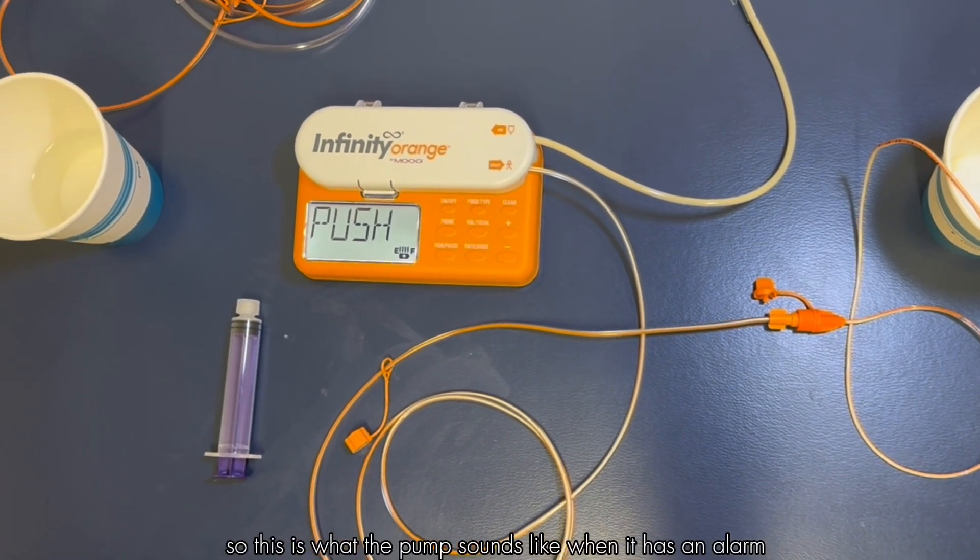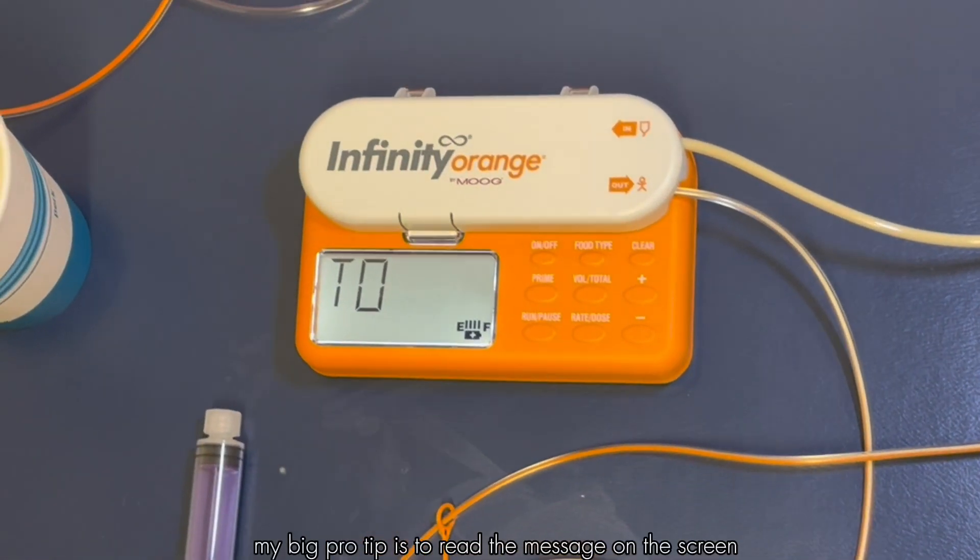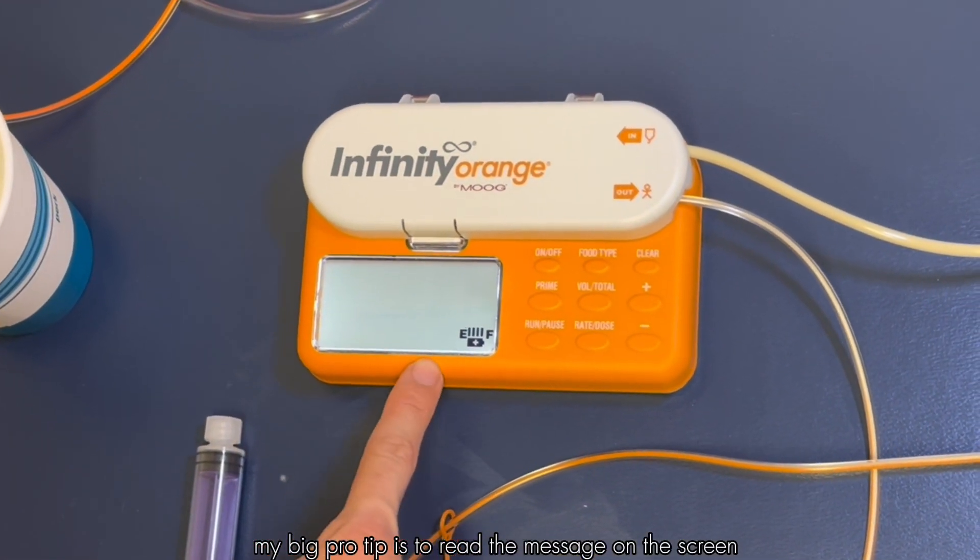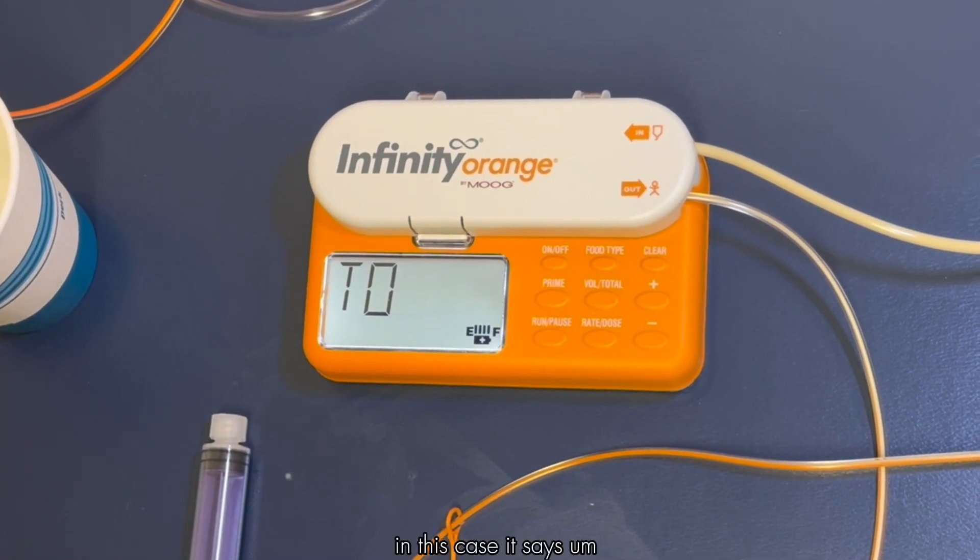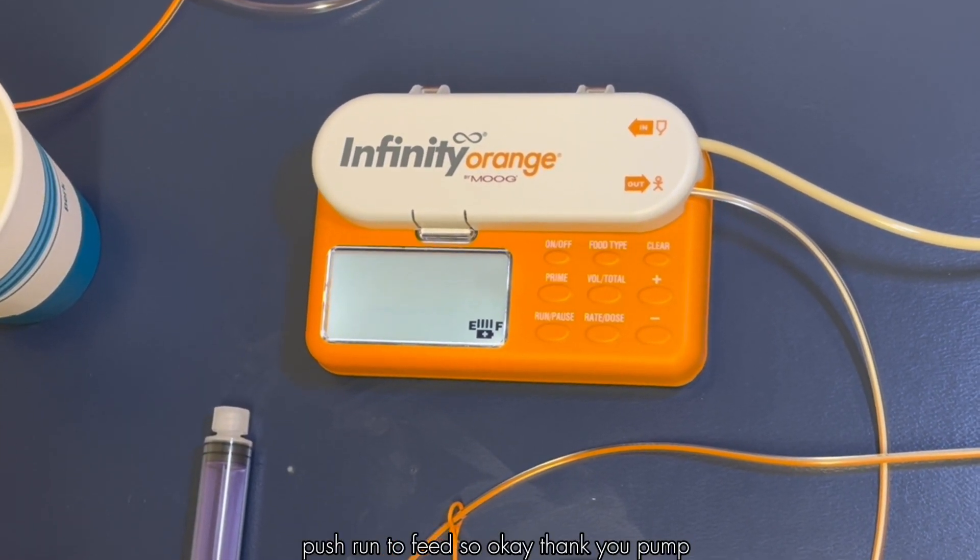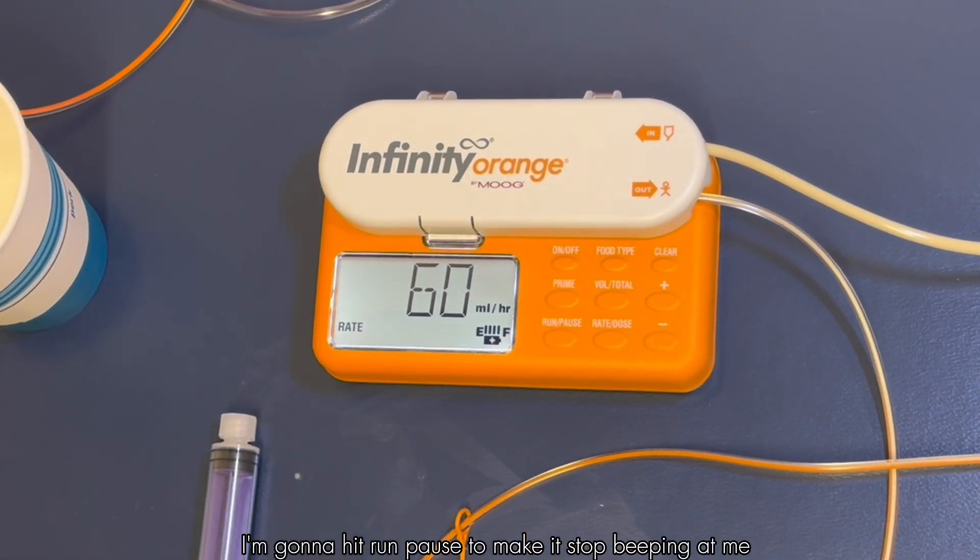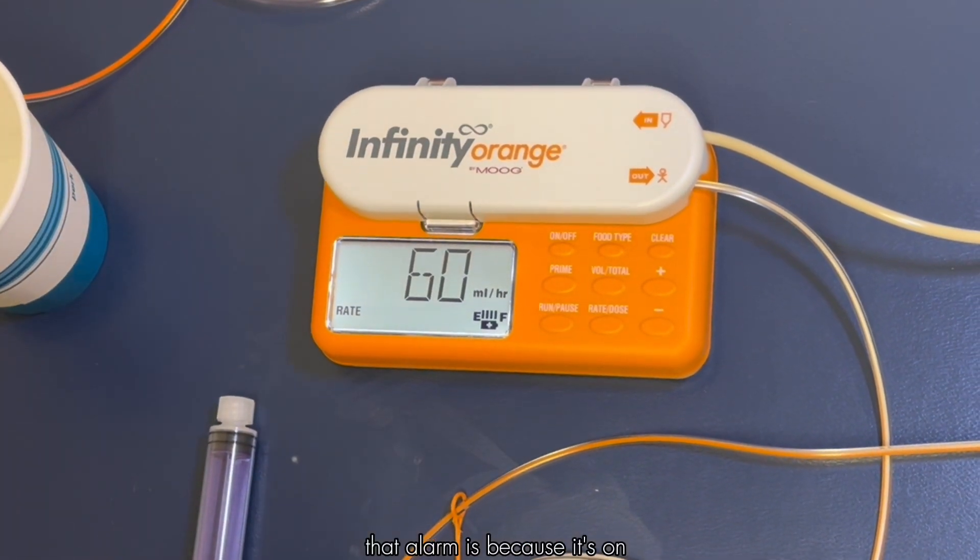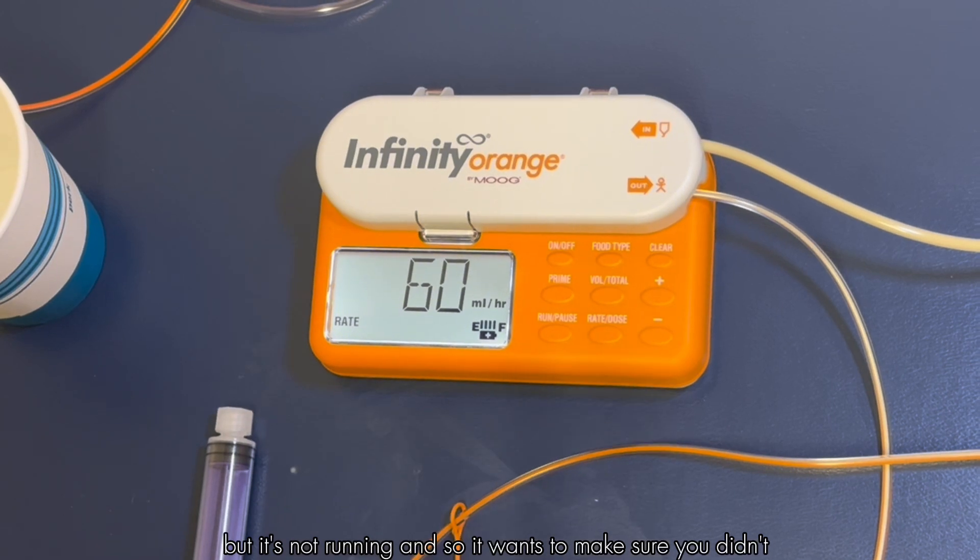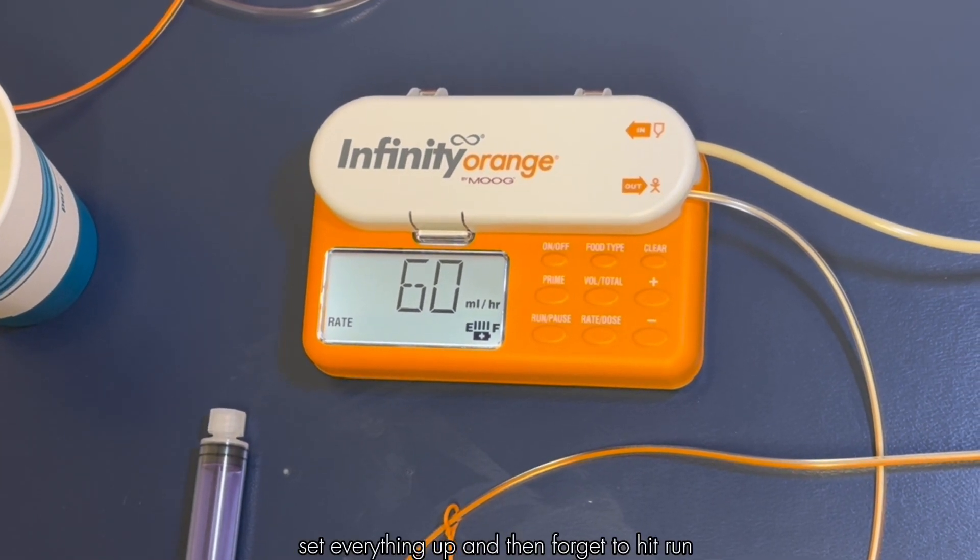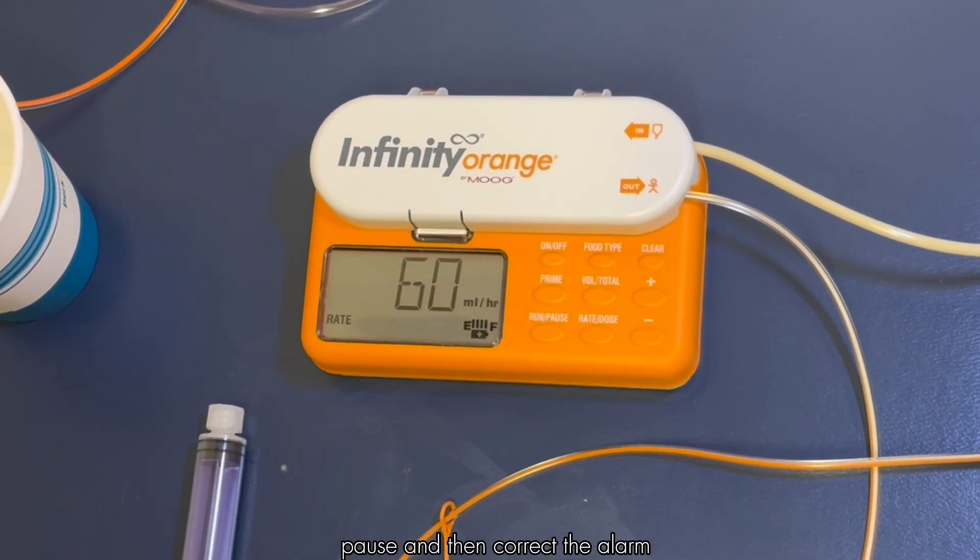So this is what the pump sounds like when it has an alarm. My big pro tip is to read the message on the screen to tell you what's going on. In this case it says push run to feed. Okay, thank you pump, I've got the message. I'm going to hit run pause to make it stop beeping at me. That alarm is because it's on but it's not running and so it wants to make sure you didn't set everything up and then forget to hit run. But typically you can just hit run pause and then correct the alarm.